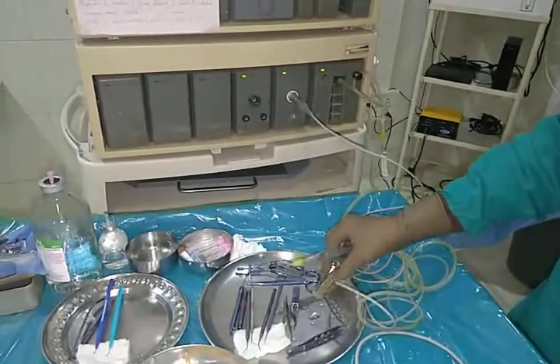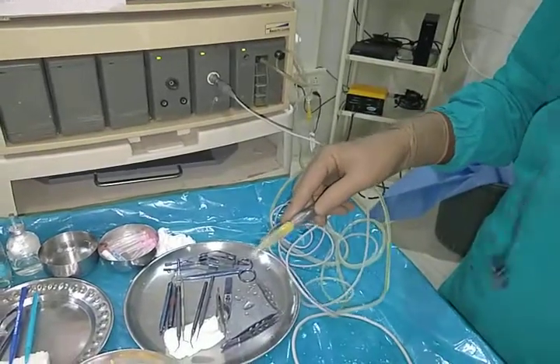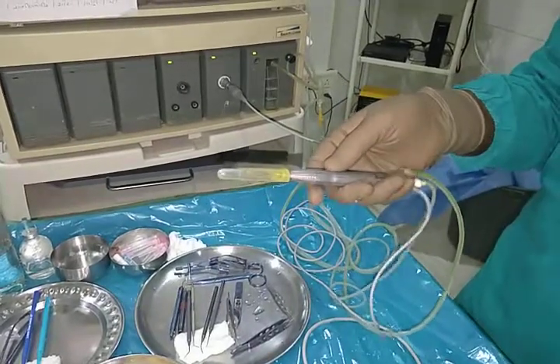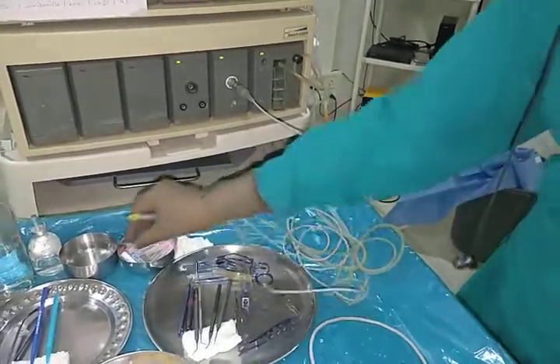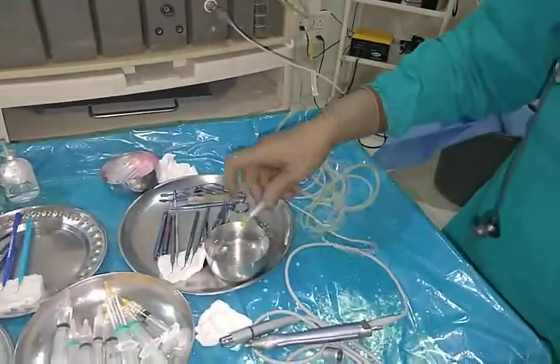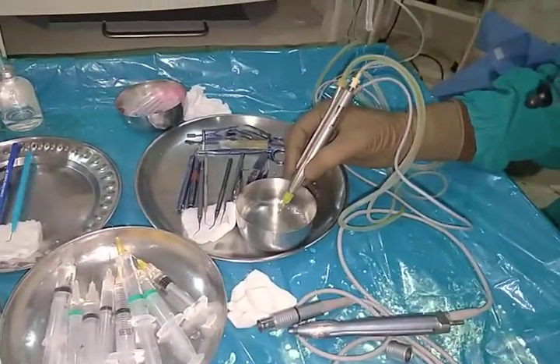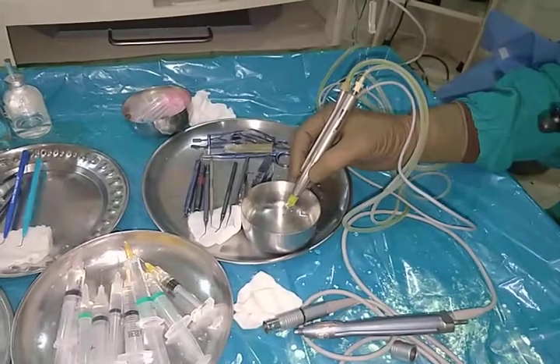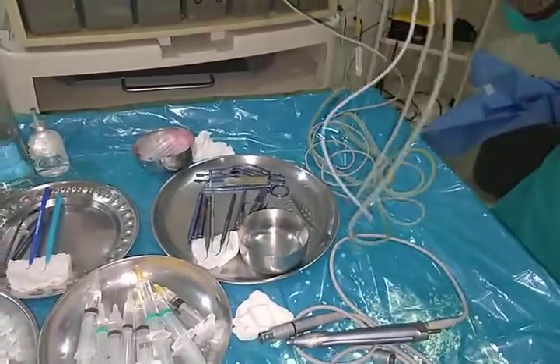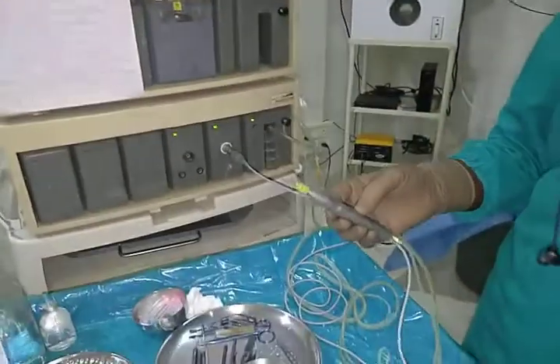Now I would like to show you it's working perfectly well. So it works perfectly well. We have done more than 50 surgeries with the help of this Stellaris handpiece attached with the console of the Millenium handpiece.